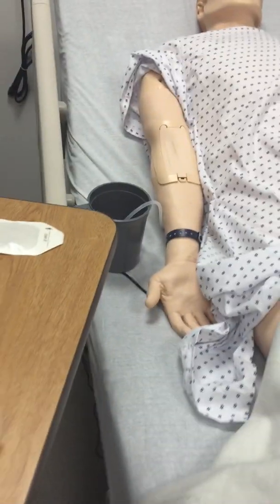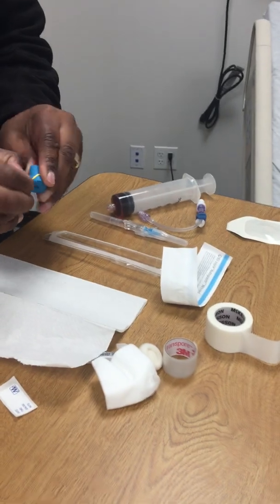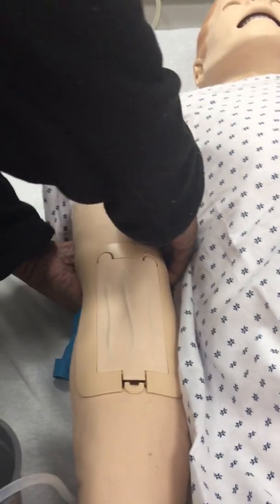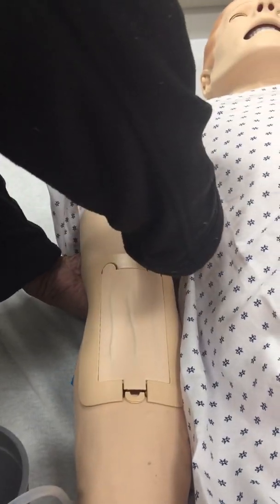We can also use the tourniquet. The tourniquet is supposed to go right here on the arm. Does it really make a difference? No, but it looks good.